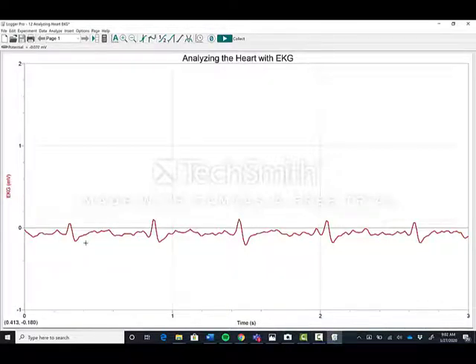Okay, so at first glance, you probably notice a few things. Number one, the QRS wave is not as pronounced, standard for a younger person, and I want you to think about the why behind it. The QRS, if you remember, reflects the ventricles contracting, and the ventricles contracting are going to be forcing blood out to the entire body. She's a smaller person than me. She hasn't done as much athletic activity, played sports for as long.